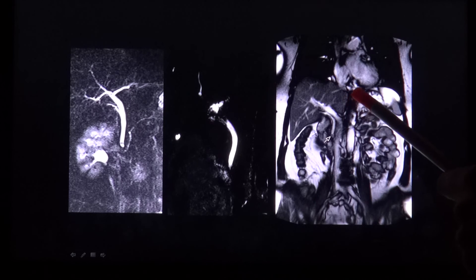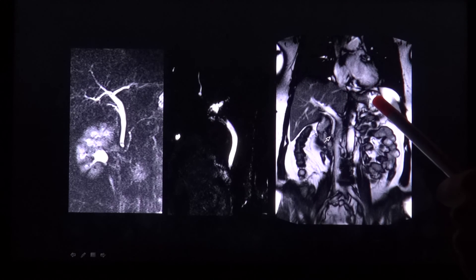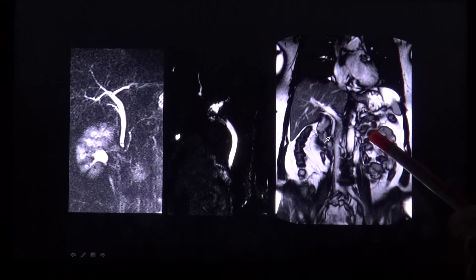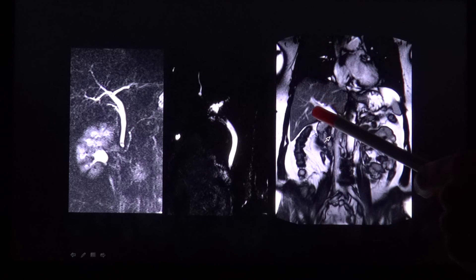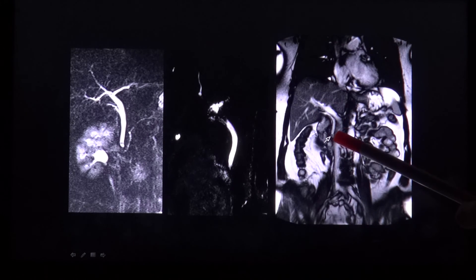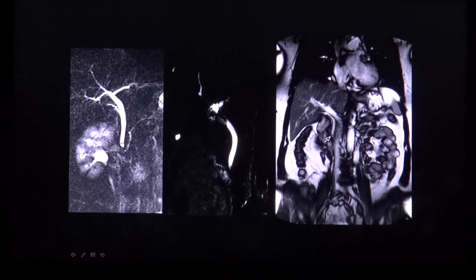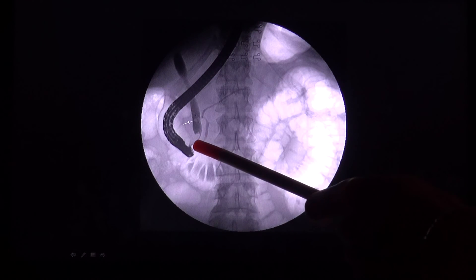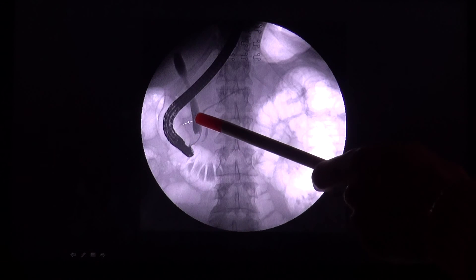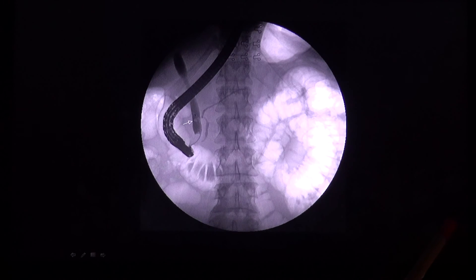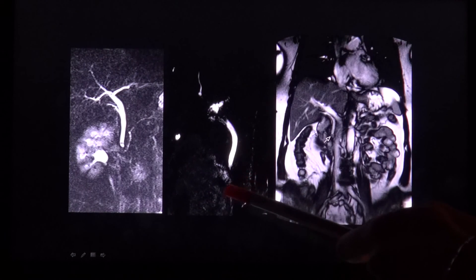Here is part of the stomach seen as well as the heart, and you can evaluate the whole adjacent tissues to the bile duct, which is again seen here, and this dot-like, very small filling defect in the distal bile duct. Correspondingly, you have an ERCP here, which shows again the filling defect in the distal bile duct. This ERCP is the corresponding exam to the MRI exam.